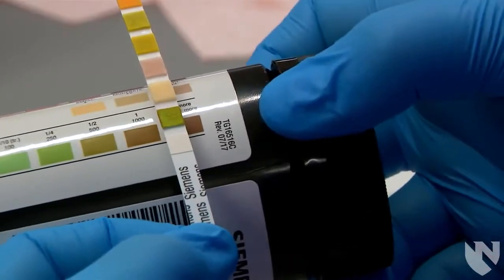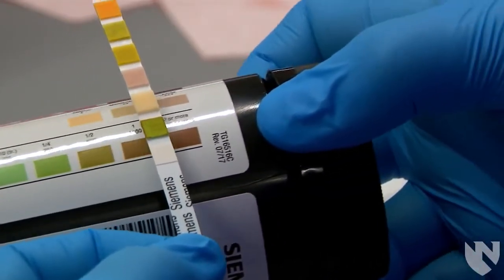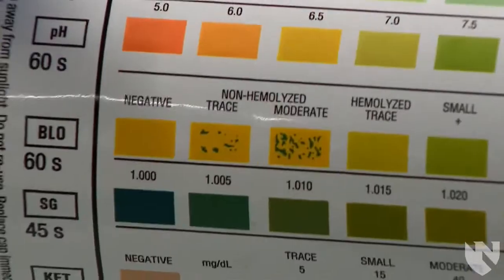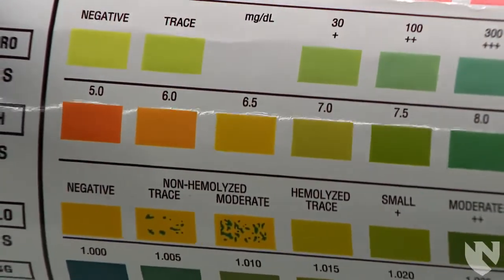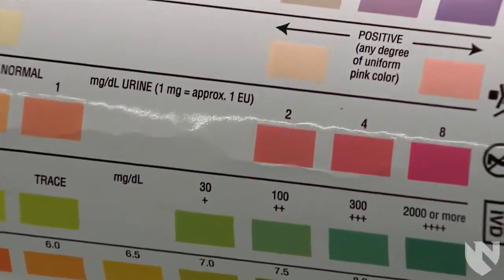Each chemical reaction occurs simultaneously, and each must be read at a specific time ranging from 30 seconds to 2 minutes. Each chemical reaction causes a color change, and we are able to compare the color on the reagent pad to the color squares on the reagent container. Each color on the reagent container gives us the corresponding concentration or value for that chemical reaction.